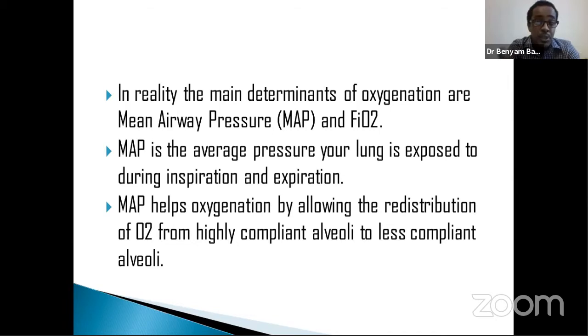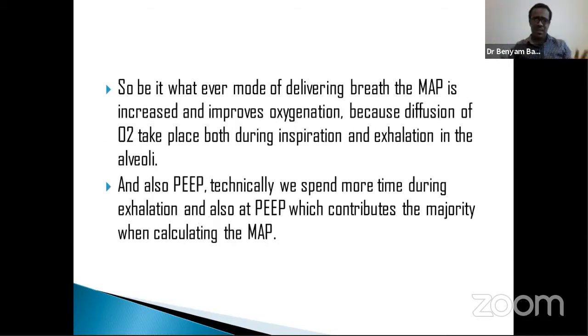So it will play the major role in oxygenation. What I mean by that is, in any mode of ventilation, be it pressure delivery or volume delivery, at the end of the day we're increasing the mean airway pressure. If you increase the mean airway pressure, it improves oxygenation, because diffusion of oxygen takes place physiologically during inspiration and expiration at the alveoli level. It does not only take place during inspiration; diffusion happens at any time. So having a mean airway pressure will contribute to this constant diffusion of oxygen.